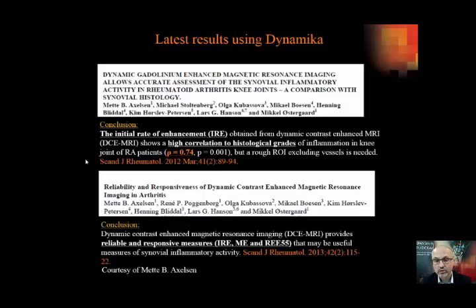It was also shown by Mette Axelsen and co-workers that there was a very high reliability and responsiveness of these dynamic MRI curves following intra-articular steroid injection in the knee joint, which means that you see fast changes when you reduce the inflammation in the patient cohort.